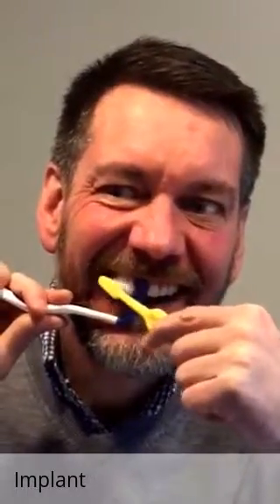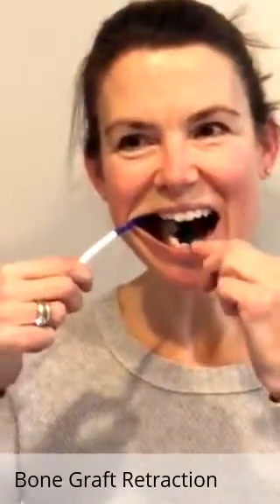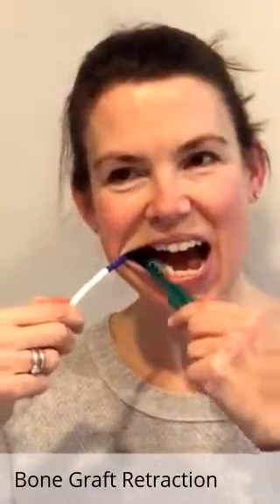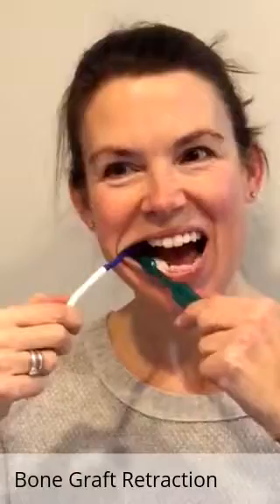You'll notice how she's now retracting that area near the implant, and she can see really well and use Tepe's brush to get in around that implant and around the adjacent teeth.